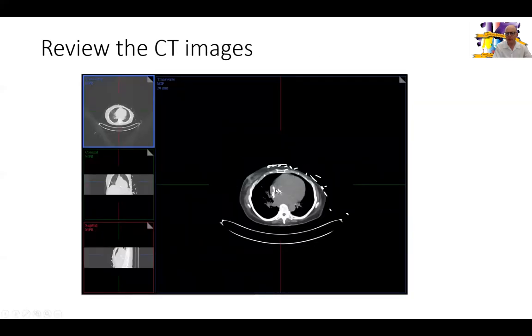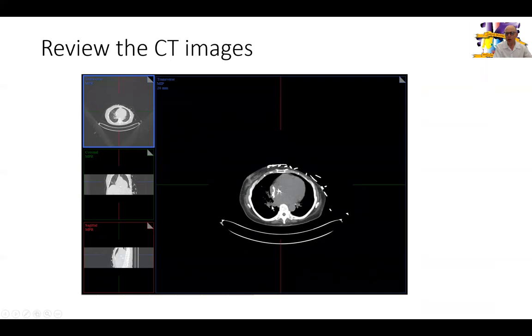Then we go to the CT images. You can see the pacemaker at the right atrium and nothing in the lungs. We review the CT to ensure there is no evidence of coronary calcification or lung or mediastinal non-cardiac findings that could be clinically important.